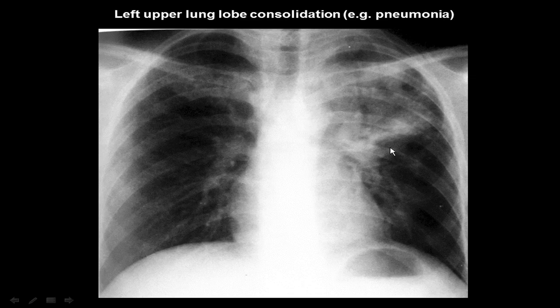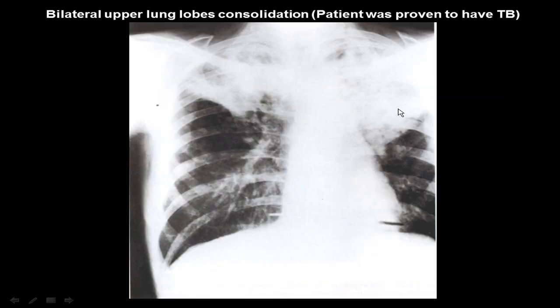Bilateral upper lobe consolidation. The plain X-ray — this is a posterior-anterior view plain chest X-ray. This is the normal density of both lungs, showing here white density of both upper lobes in this patient.